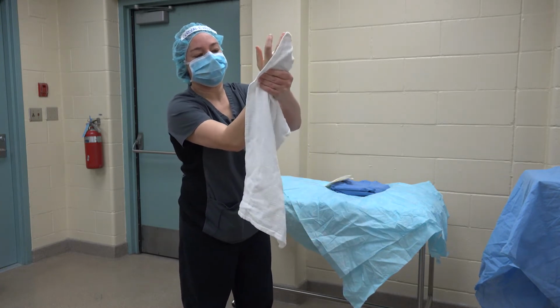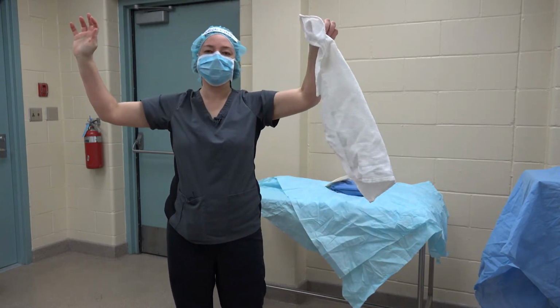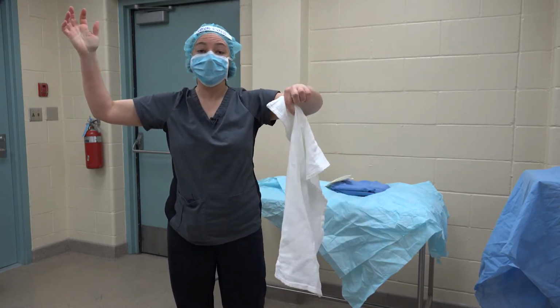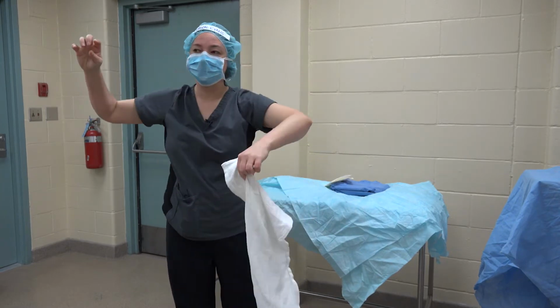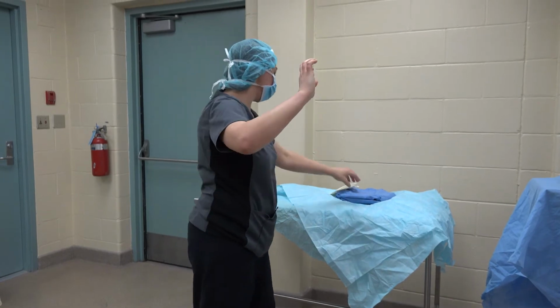And I'm going to dry my right hand. All right, now this is dirty because I went all the way down to my elbow. So I'm not going to put it back on my sterile field. I'm going to throw it. This is the only time you get to throw stuff, guys. It's super fun. All right.